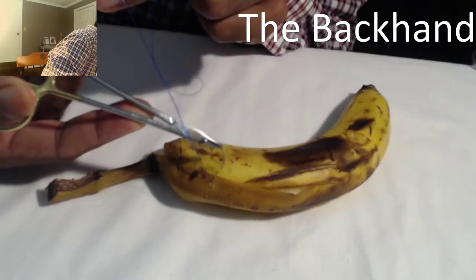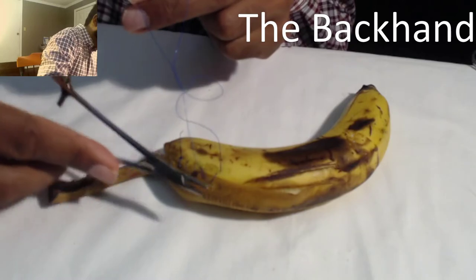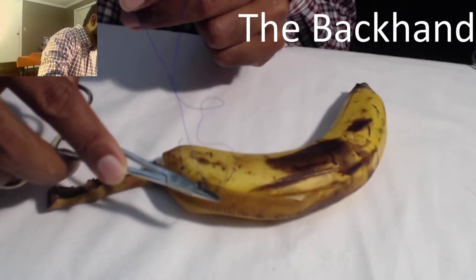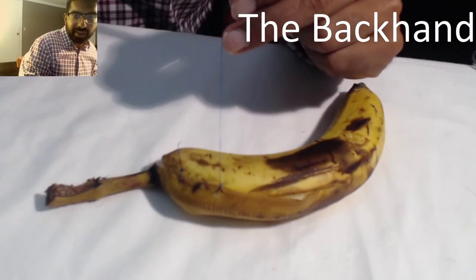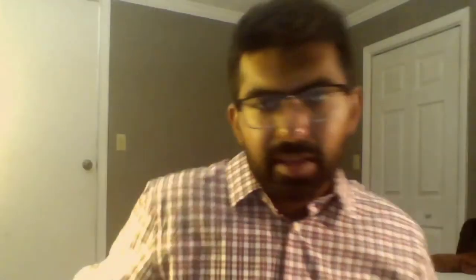Let's try to make some errors. With the backhand, if I take it here and lift up, notice how the banana is moving up — that gives you a sense of how much tension you're putting on it. If you're not putting any tension and are using the curve of the needle, the banana should not move, and you should feel the needle move without a lot of resistance. If I just pull this through, you can see the banana moves and there's a tear in that tissue. This is how you start getting a feel for what's a good bite versus a bad bite.